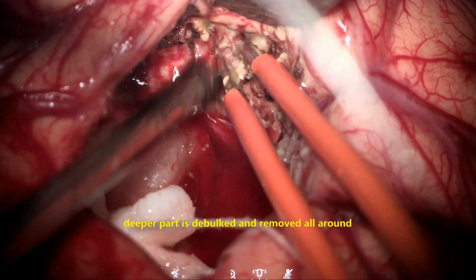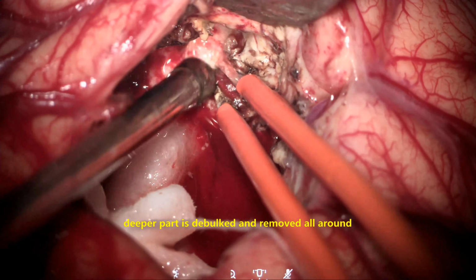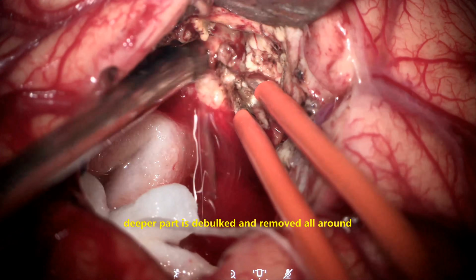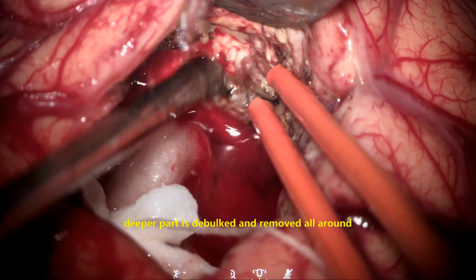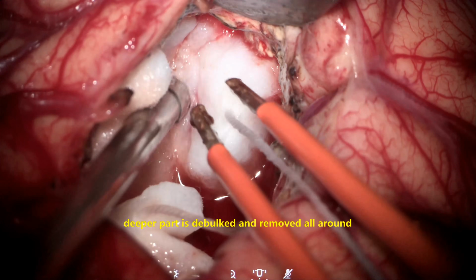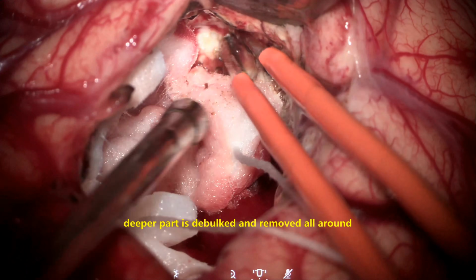Now you see the posterior and inferior part of the tumor is debulked and hemostasis is achieved. Here we feel we have reached the complete periphery of the tumor where normal brain is seen, and we decide to stop at that after achieving the hemostasis.